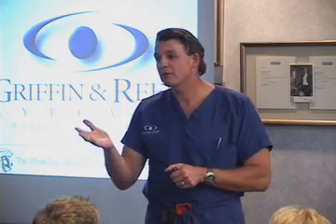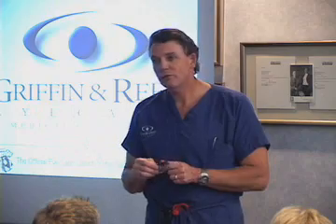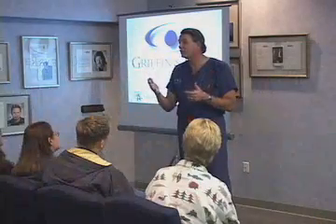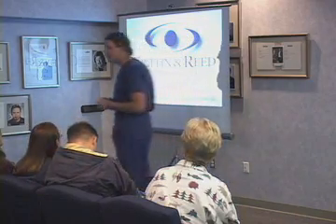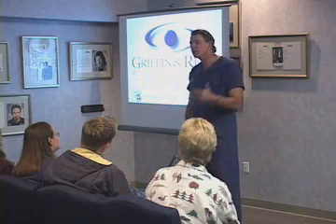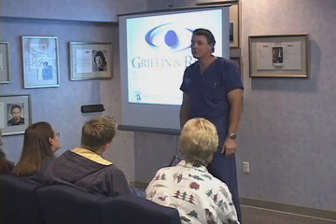If you're hitting in the 95, 96 percentiles for moderate powers, those of you that are in the low power range, 98+% of the time, we get you there the first try. So you don't want to pay custom rates for something you don't need. So we'll go over it with each one of you and decide based on your evaluation individually whether or not we think you need it. And I would guess about 25–30% of the people we see end up needing it, and about another 10 to 15% decide they want it because it does enhance night vision in some, and it does increase the possibility of seeing better than 20/20 by about 65%. And some people want to go for that.